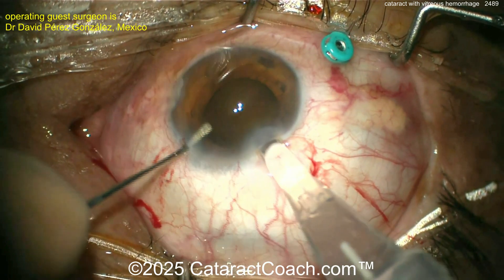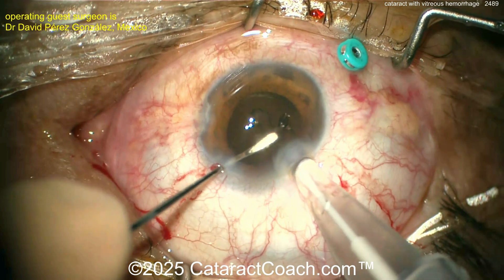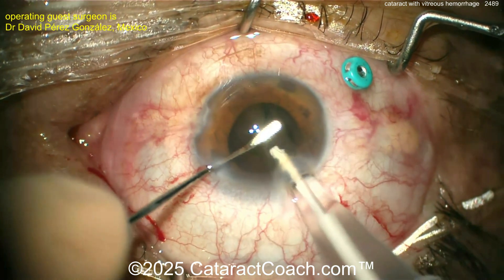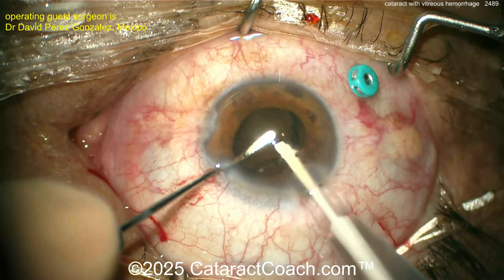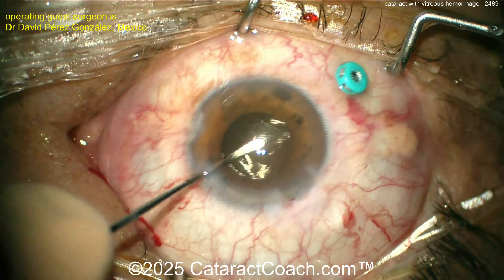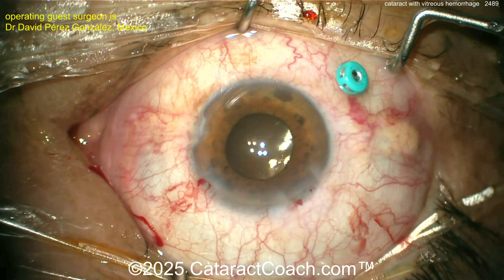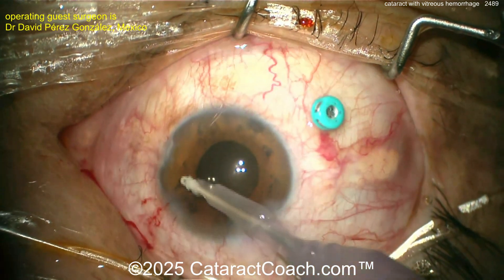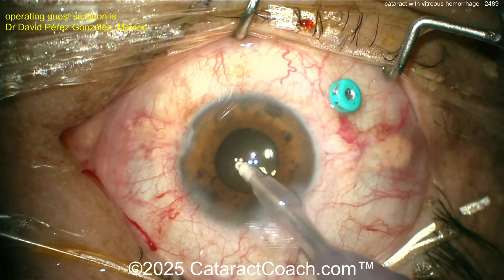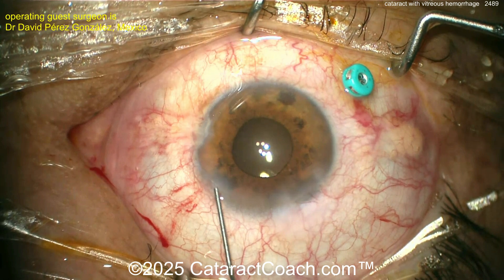Lens goes in. In a case like this, remember to make a reasonably sized capsulorrhexis — don't make it jumbo-sized — because you want the IOL to stay in the capsular bag even if you have to put a large gas bubble in the eye for a long period of time. You don't want pressure causing the lens to pop out. Here's the lens — looks like a hydrophilic acrylic lens with four haptics — giving good stability in the capsular bag. Now evacuate the viscoelastic, seal up the incision, and continue with your pars plana vitrectomy.